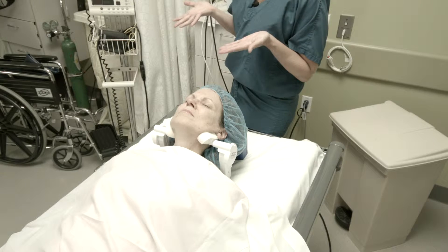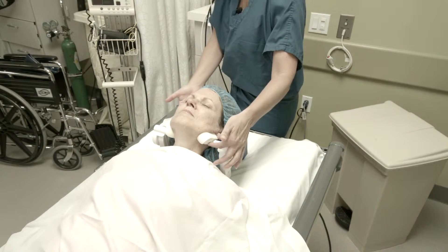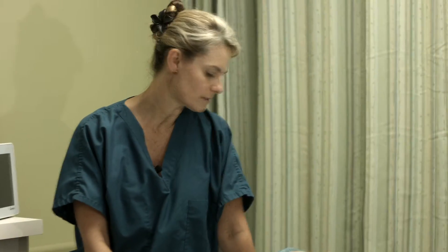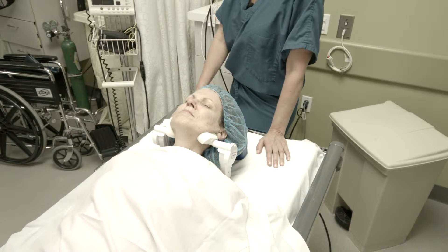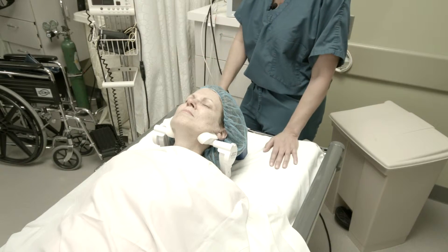The GED can be used on around age 6 and up because it's based on jaw width. The GED accommodates any jaw width between 10 centimeters up to 21 centimeters. The largest patient we've had the GED on was around 420 pounds and the smallest was around age 6, so it accommodates most of the population.